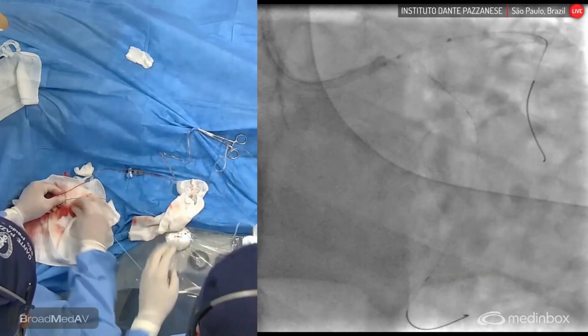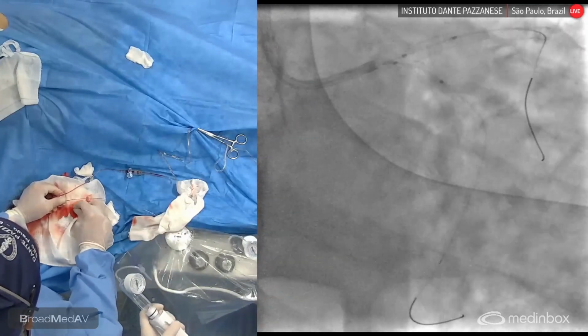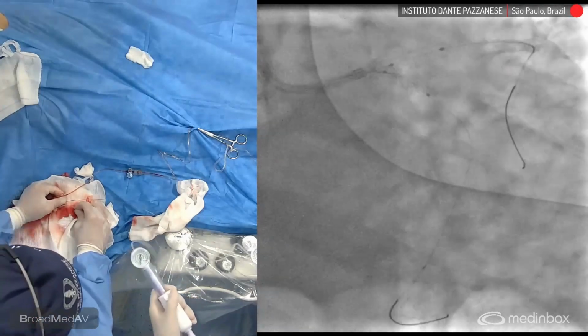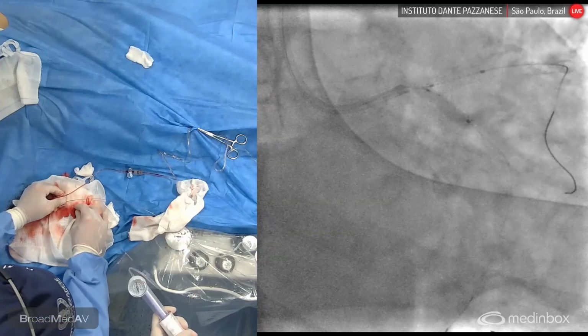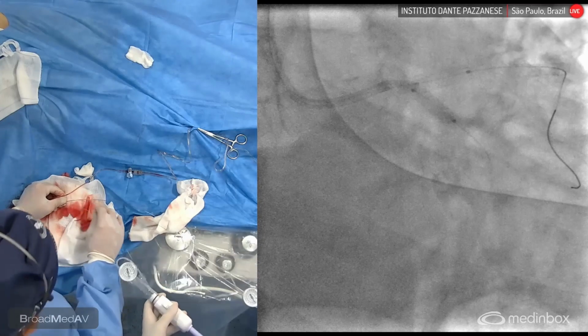What do you think, Louis? Does it make sense? Yes, perhaps yes, because it's a left main. Okay, see, 3.5, it went very easily. Smoothly. So we're gonna go first here. We're gonna go high pressure, 25.